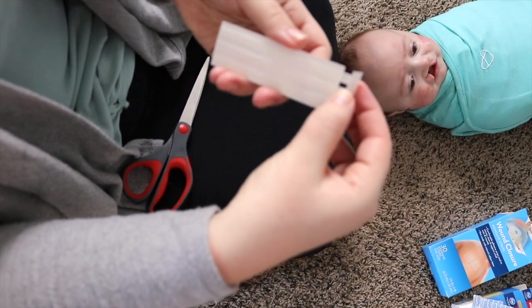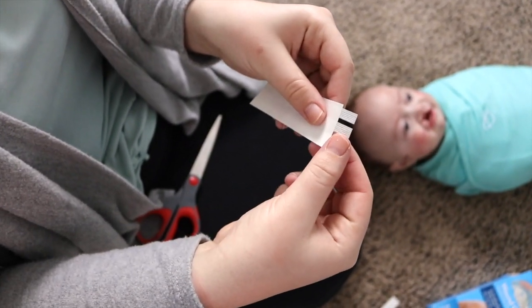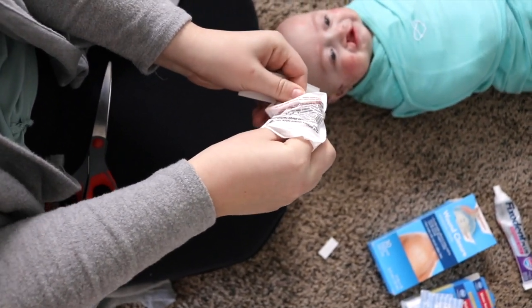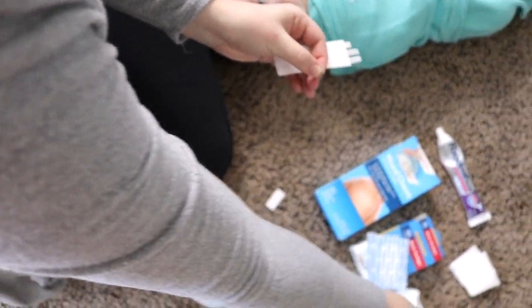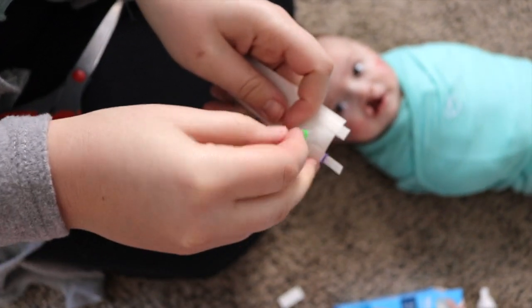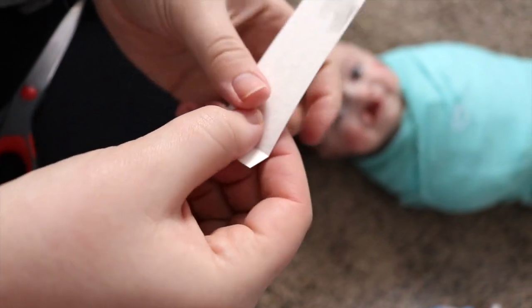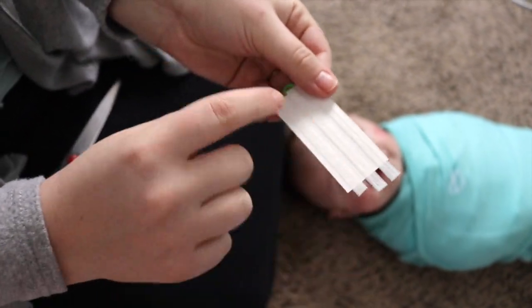I start off by cutting three of the wound closure strips and then removing the backing from the top. I fold down one of them to create our mustache tape. Then I grab the little bands and remove two of them. I take those bands, stretch them out, and pop them around the top of those pieces of tape, then fold the tape down over the band so that it secures it in place.